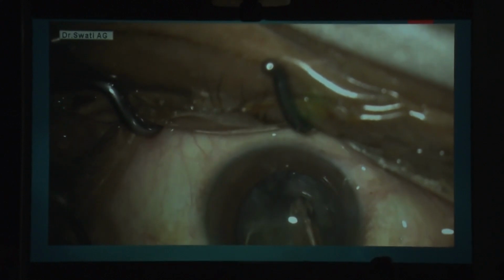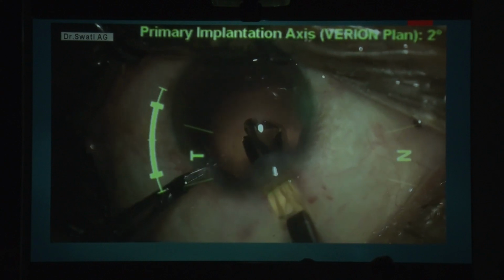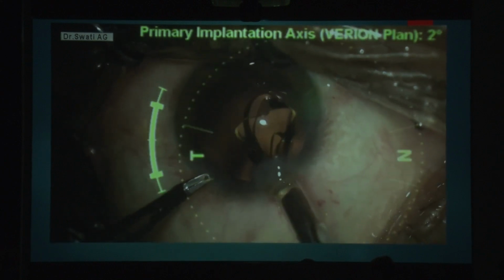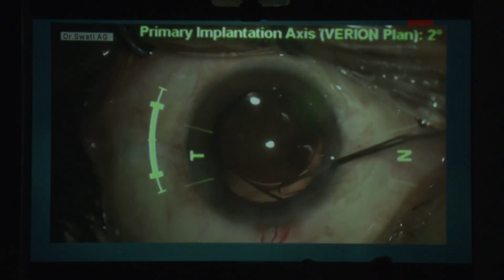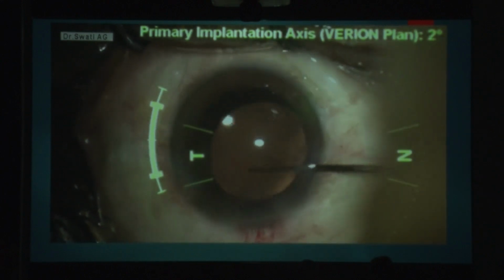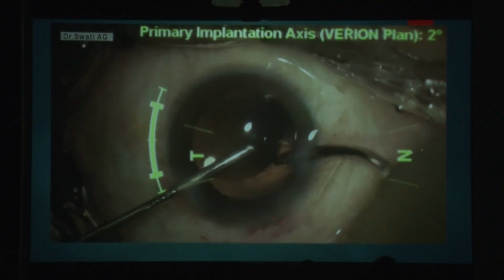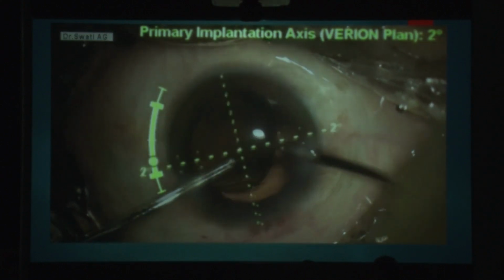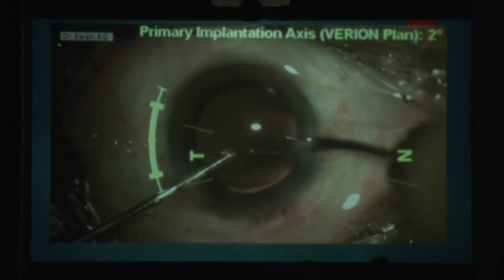And what we need to do is just proceed with the normal surgery. After the phacoemulsification has been done, we just need to implant the IOL as smoothly as it is, without worrying about the orientation of the chart and which axis to give. It just makes the mind of the surgeon very calm and peaceful. So over here it's marked at 2 degrees. We also need to wash behind the IOL so that the post-op rotation is limited, and this is how it is done.